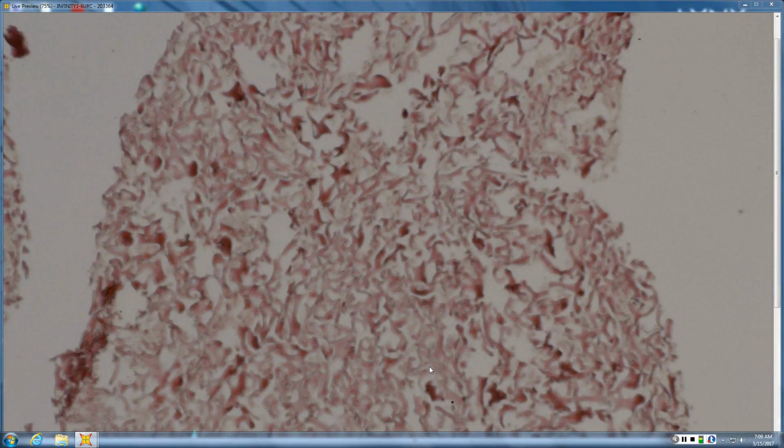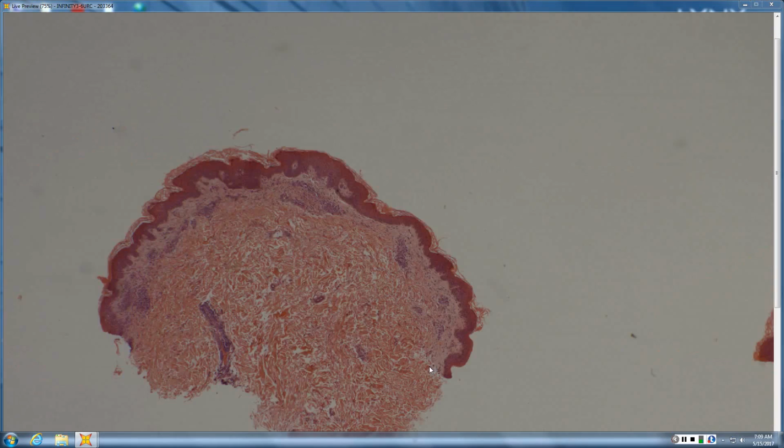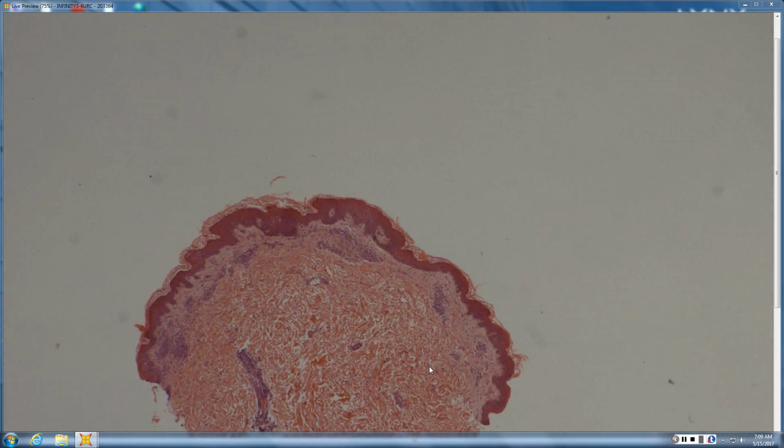And so this is an arabesque pattern, and it has also that kind of sclerotic appearance. So, it's pretty characteristic. And hopefully there'd be a history of surgery and stuff, or some sort of procedure.